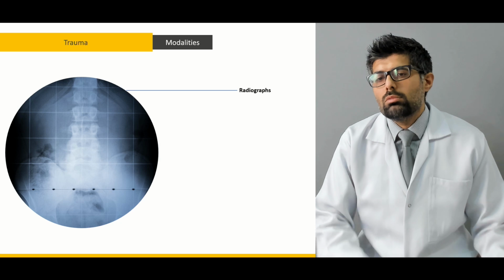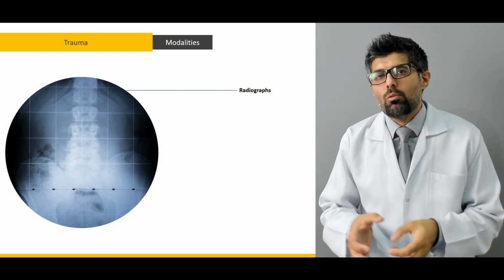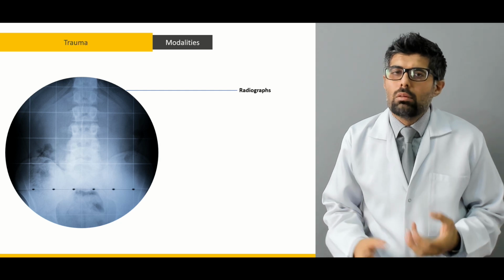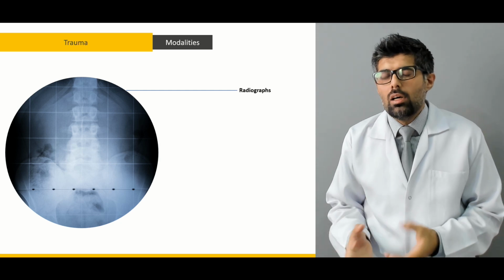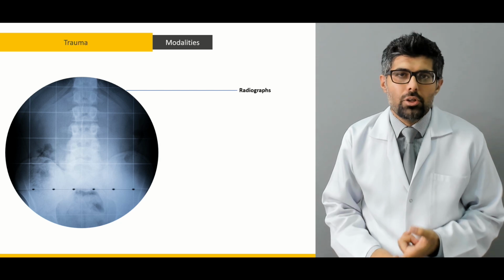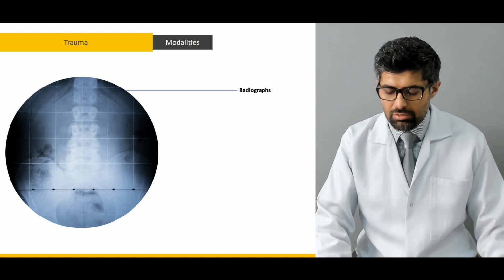The first one to study is the normal radiograph, the plain X-rays. Now for the urogenital systems, we do not perform plain X-rays. The usual X-rays are mostly contrast enhanced. Usually some kind of retrograde study is done. And even if it is not enhanced with a contrast, we perform what is called a KUB X-ray, that is your kidney, ureter, bladder. So only that part of your abdominal cavity is highlighted in the X-ray.